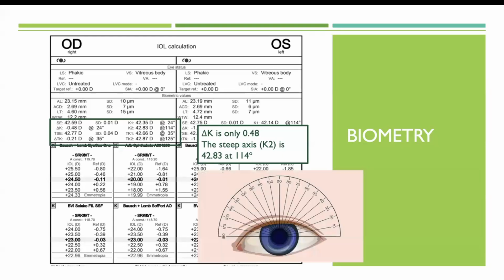So if I take a quick reminder, if I look at this diagram now, just bear in mind that the actual angles on this eye are correct, but please imagine that the eye you're looking at is actually the right eye, not the left, even though you can see that caruncle on the left-hand side. So this isn't a left eye, this is a right eye. And these angles are essentially where the angles are on the right-hand side, and it's exactly the same on the left. So it's 180 to your left-hand side down to 0 on the patient's nose on the right eye, and then again it starts at 180 and then round to 0.